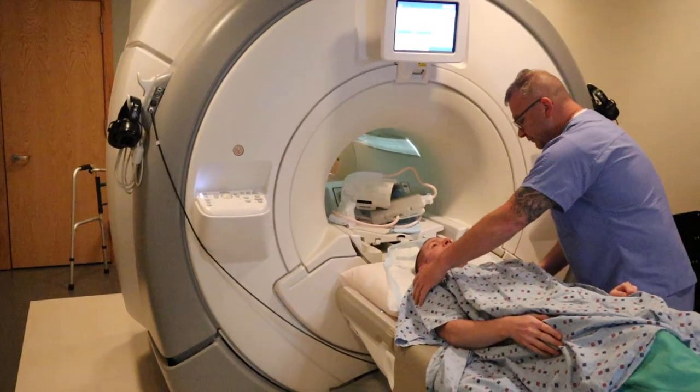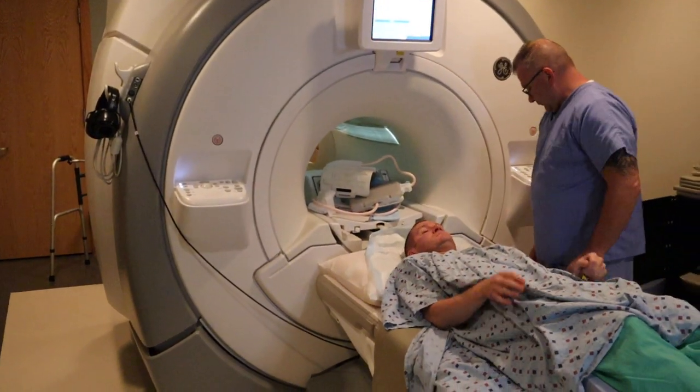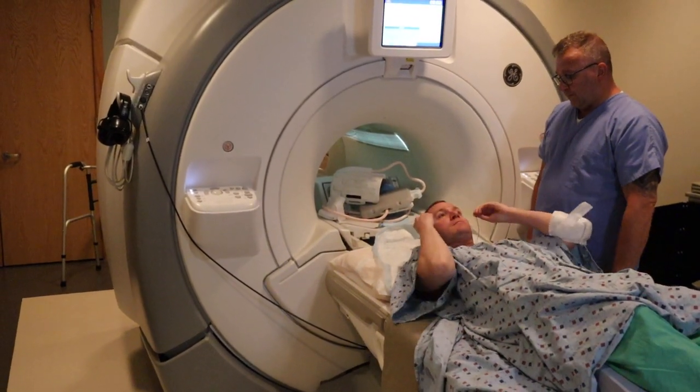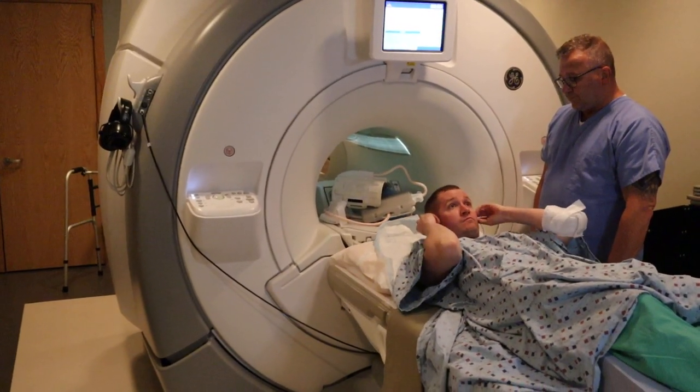You want to have the patient off-center to the opposite side. For example, if you're scanning the right shoulder, you want them offset to the left.